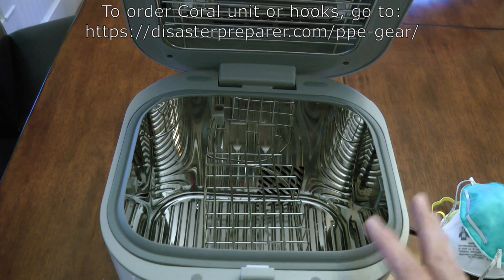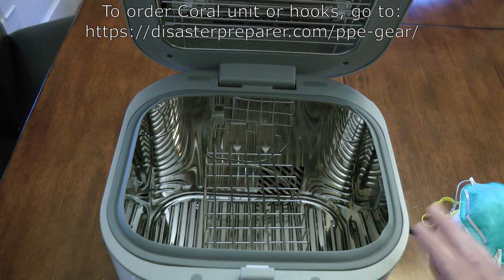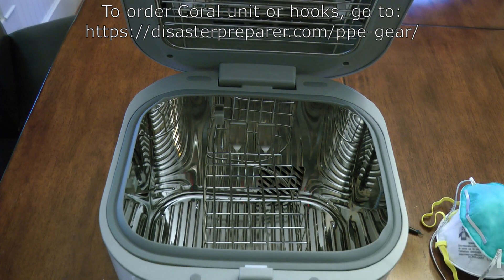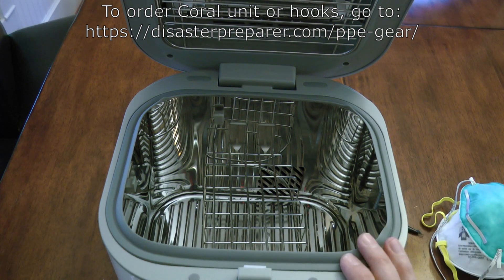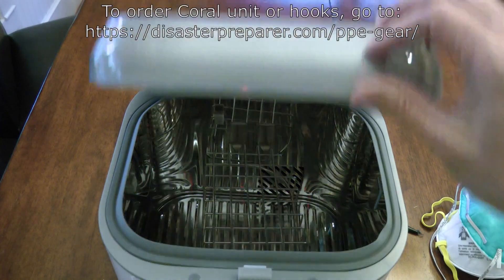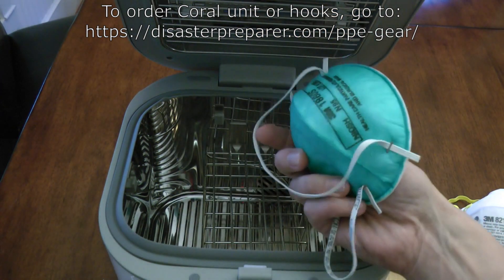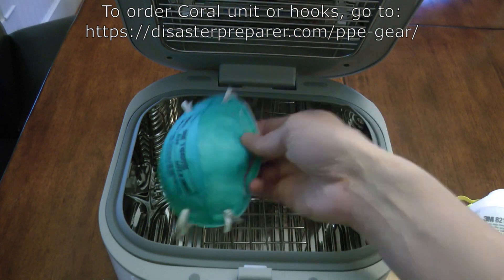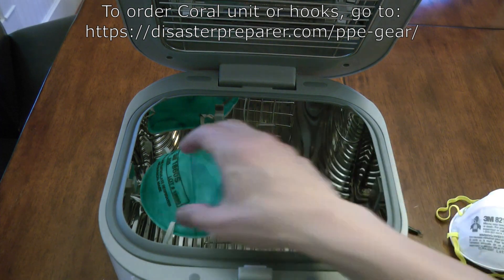You can get a really good buy on this Coral unit — I'll put the details either on screen or down in the comments. I think they're running some specials; they may not ship until maybe May. But in my opinion, this coronavirus thing is going to be going on for quite some time — it's certainly expected to start back up again in the fall, even if it goes away in the summer. So I would really recommend you consider getting one. These respirators are very hard to find, and once you get them, you want to use them as many times as you can. This gives you a way to decontaminate the surface of them so that you can reuse the masks.